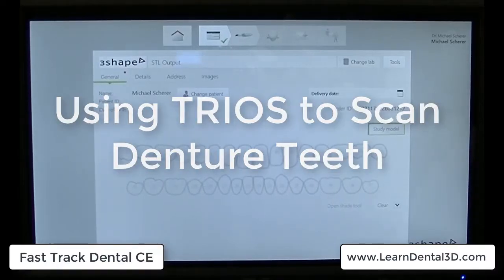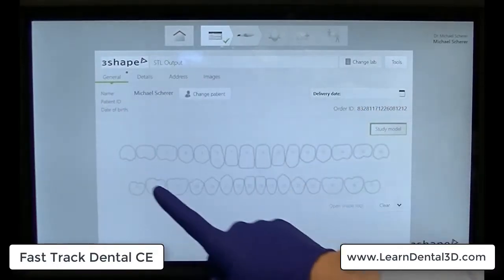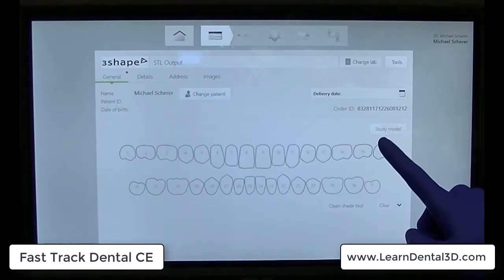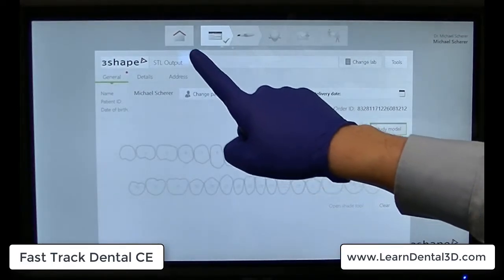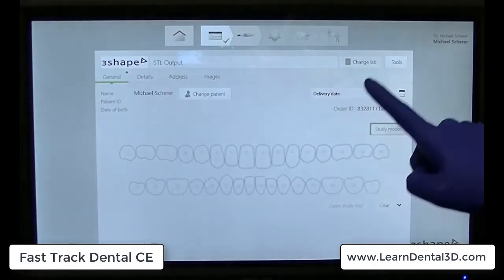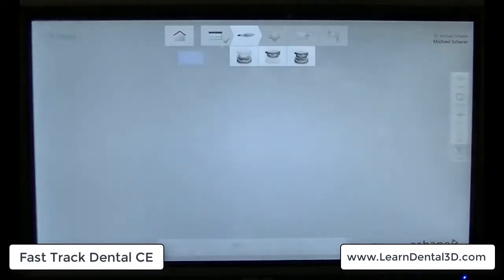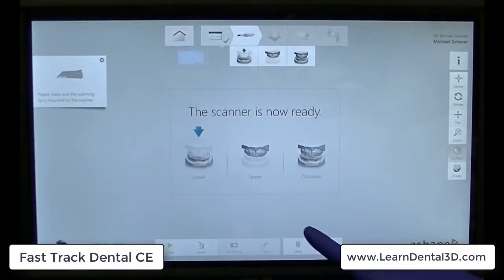Hey everybody, this is Dr. Shear with FastTrack Dental CE. In this video I'm going to show you how to use your Trios and STL output to go ahead and scan a denture tooth card to use it in creative methods.